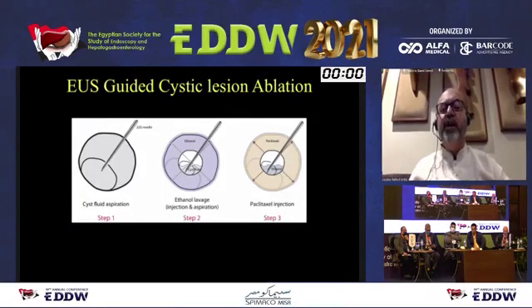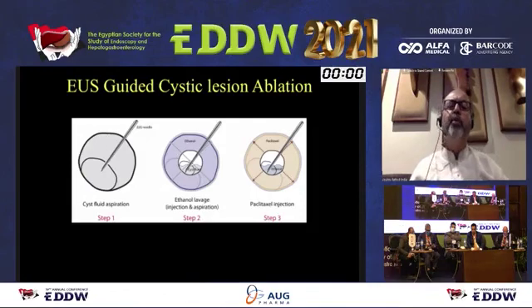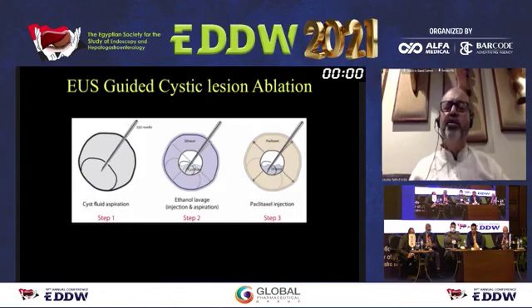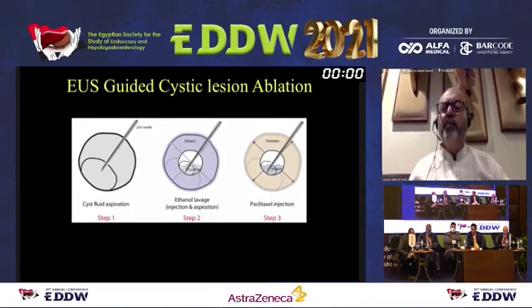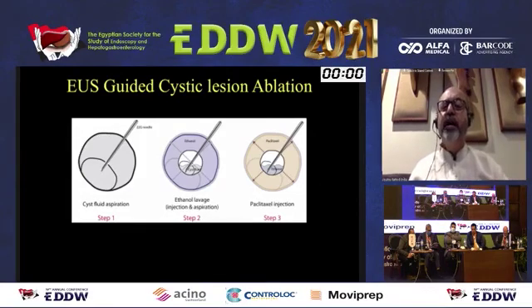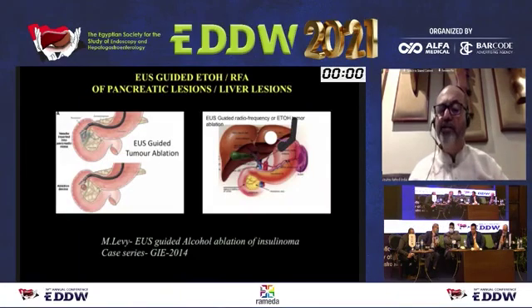Coming to EUS-guided ablative techniques, we have heard Brugge and others at Mayo talk about insulinoma treatment and cystic neoplasm, alcohol ablation and paclitaxel and all those things. But I want to ask you today, if a patient is reasonably surgically fit, I still feel that these are techniques which are still questionable. So I want all of you to ask a question. Suppose this patient is your family member in their 50s and the cystic lesion is resectable. Would you offer this procedure or do something else?